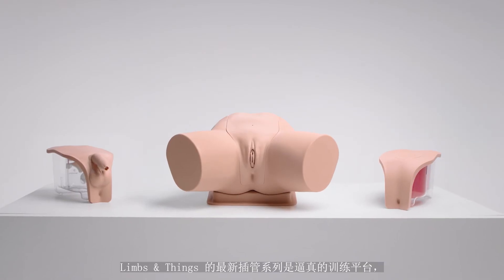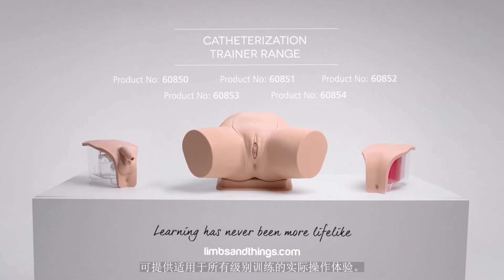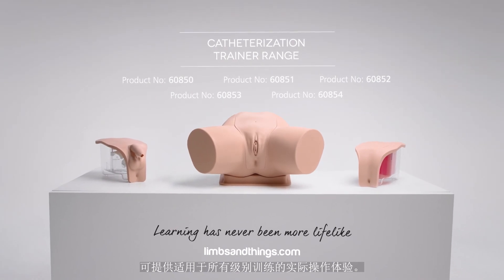The latest catheterization range from Limbs & Things is a cost-effective, closer-to-life training platform that provides hands-on experience for all levels of learning.